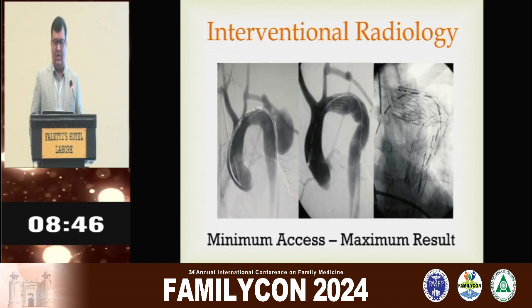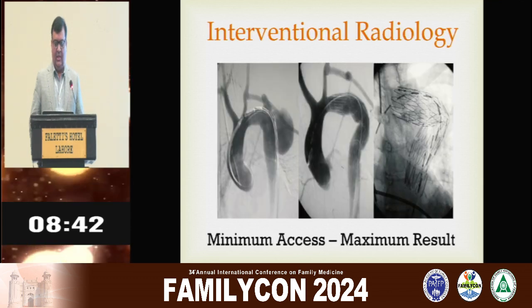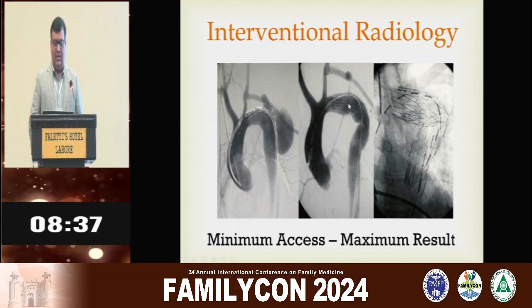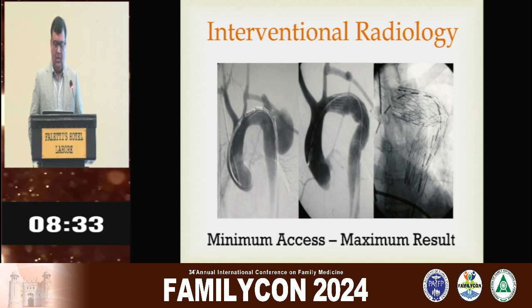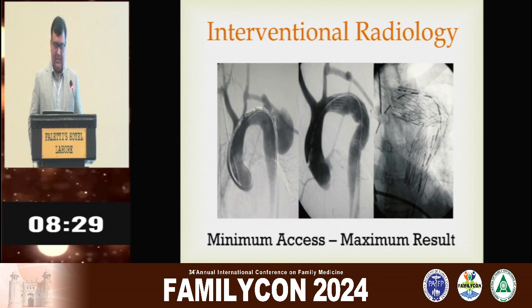This is one example of minimally invasive surgery. You can see a big traumatic pseudoaneurysm, and we can place this stent percutaneously with a small hole. If this ruptures, the mortality is 100% in such cases.